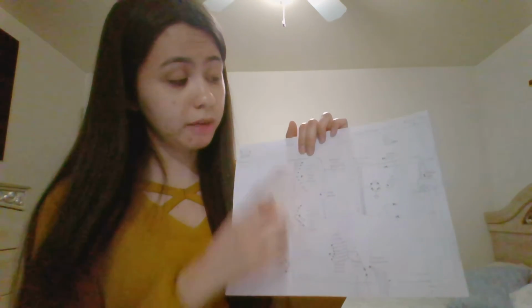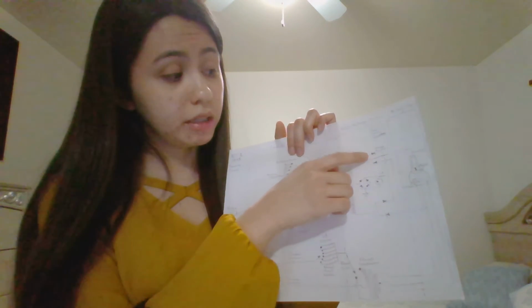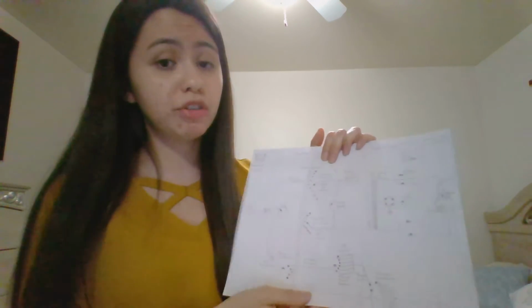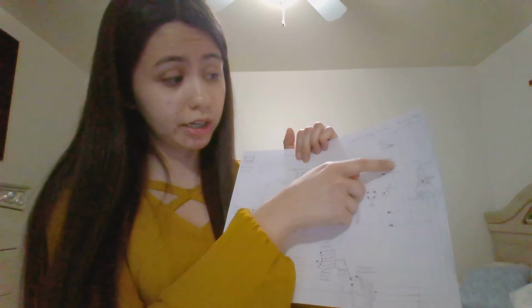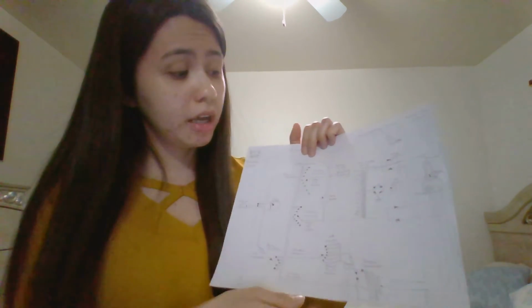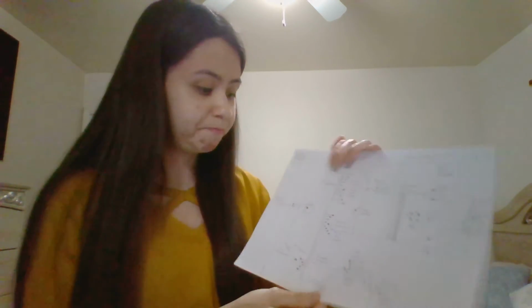And for X-ray circuitry to work, we need it to be direct current. So the way that the X-ray circuitry accomplishes this is by having its voltage go through these little diodes. And the diodes that we typically use are solid state silicon semiconductors. They go through, and the diodes will rectify the charge, which just means they convert the AC current to DC current. And once it's all DC current, it's going to go on through and go onto the anode. There's also an mA meter here, and the mA meter is just going to measure what the mA is going to be at the end.